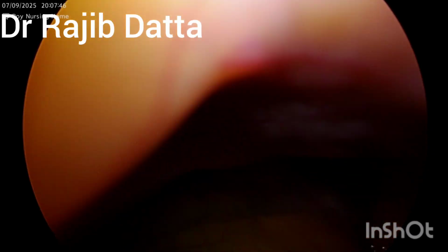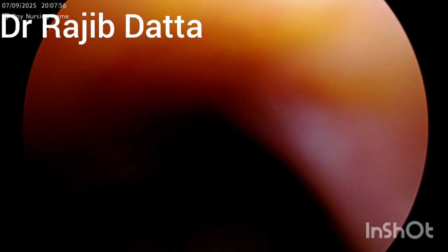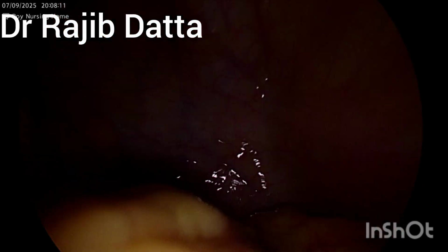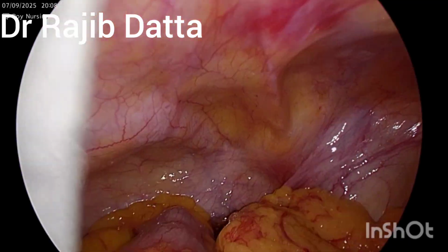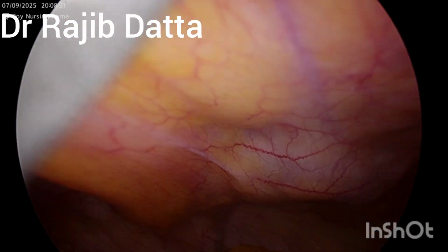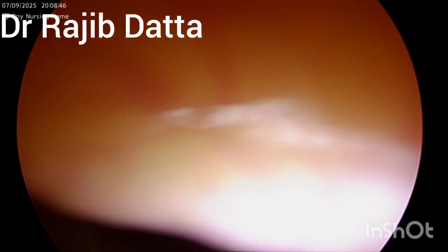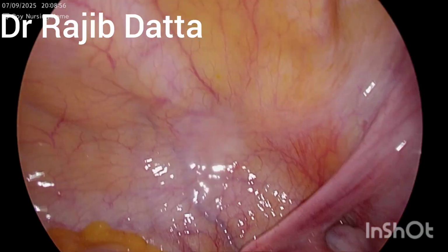and you can well appreciate that the right iliac fossa can well be visualized. And we are going to see the pelvis. The median umbilical ligament can well be visualized. The medial umbilical ligament, you can well appreciate on both the left and the right side. And here the patient's positioning has been changed, to a 15-degree head down position.